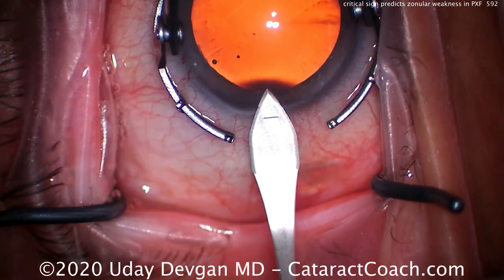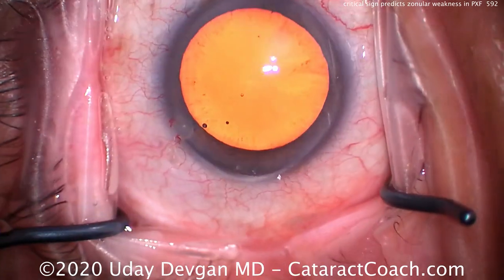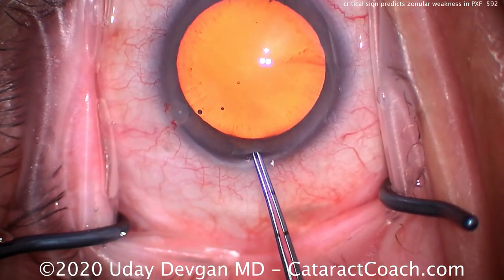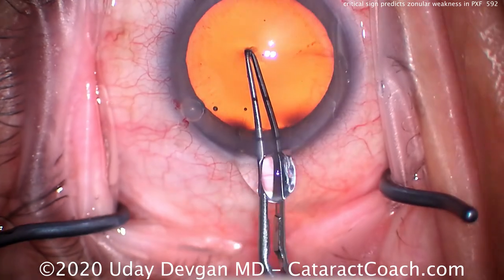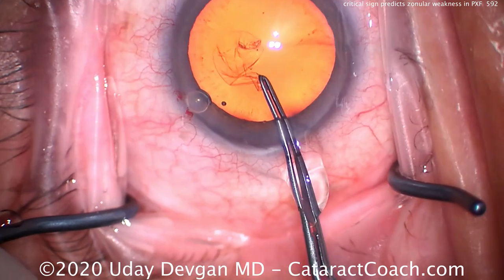We've already filled the anterior chamber with dispersive viscoelastic to protect the cornea, and we'll start our capsulorhexis. When we start the capsulorhexis, we look carefully at the lens capsule to see if there is any wrinkling. We poke in — it looks pretty good. The capsule is nice and taut, no wrinkling. That's a great sign.